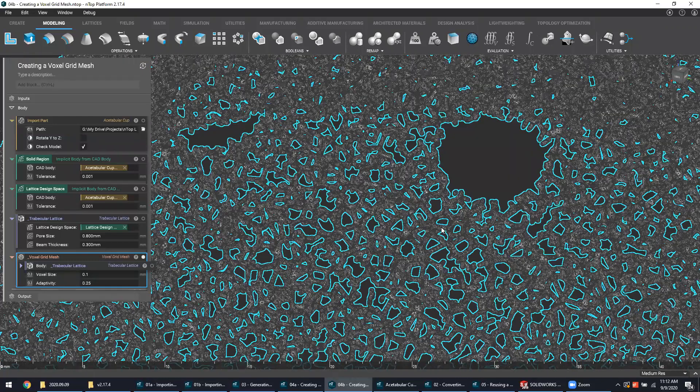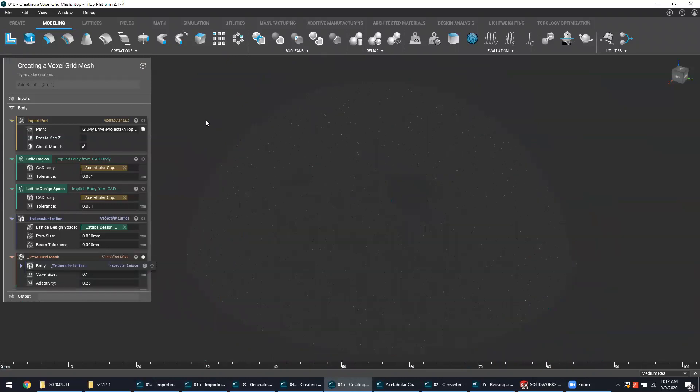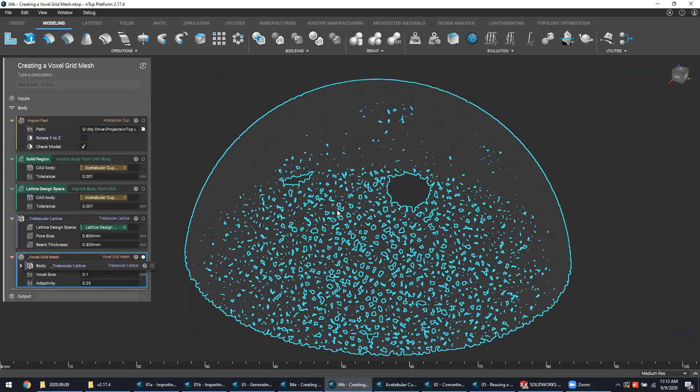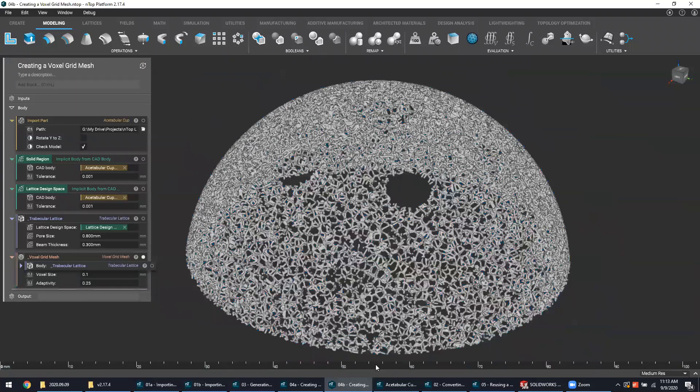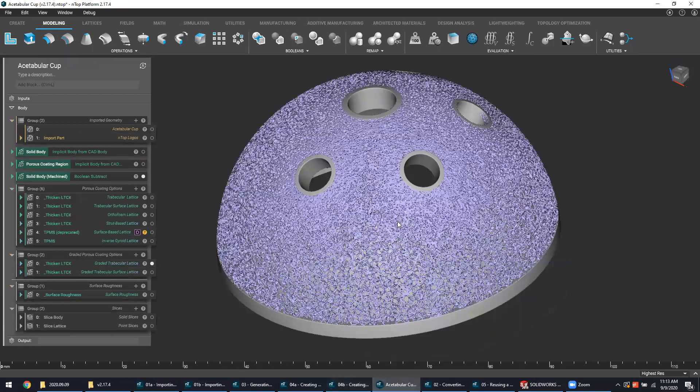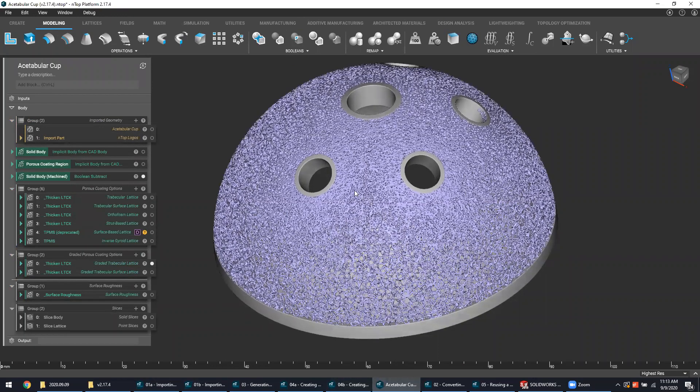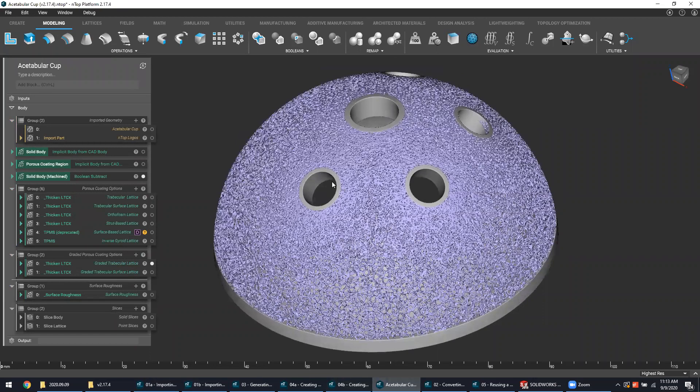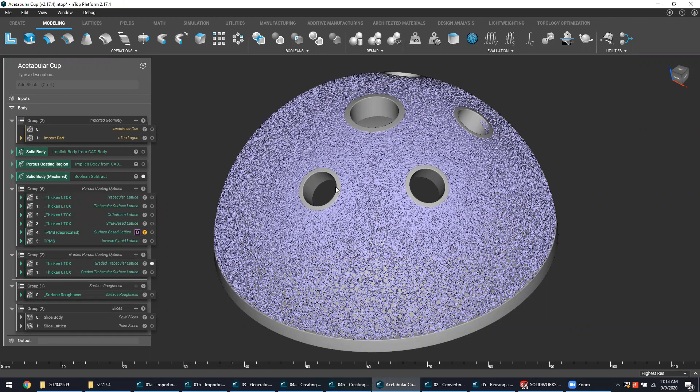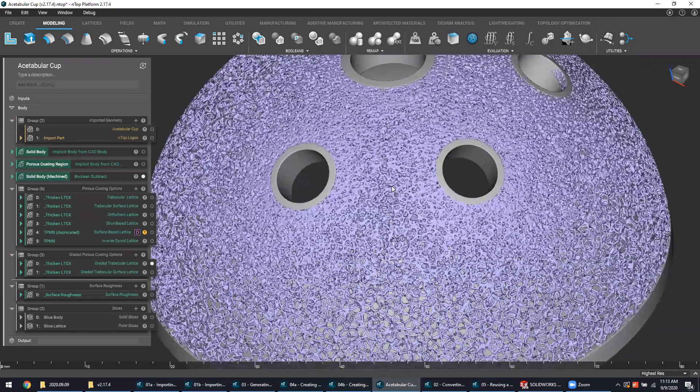Though everything I said before is what you'd expect from a standard workflow, NTOP platform offers many different ways to tailor the geometry for your unique needs. One of the ways that can be done is by selectively introducing gradients into your geometry. In this example, one of the many different variations I have for the trabecular surface structure on this cup, I have this graded randomized lattice.